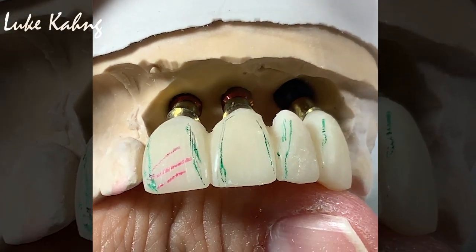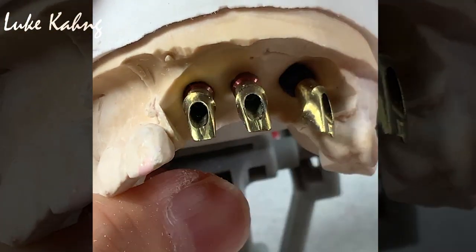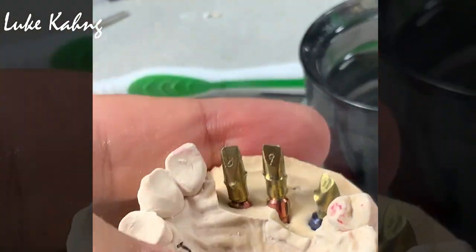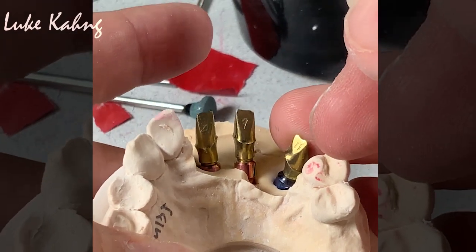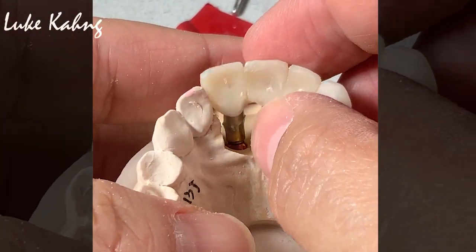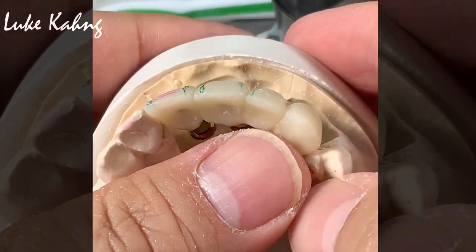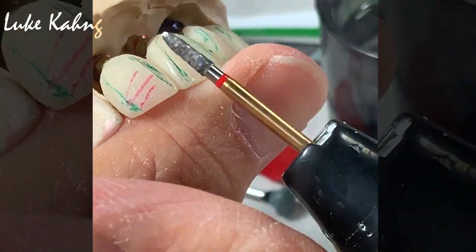Alright, today's final case is a rush for the temporary, the 3 implant. Right, so we made a great abutment. I know this abutment is too short, so we recreated our custom abutment, which is tall enough. That's our job, trying to create a little bit better aesthetics from here.